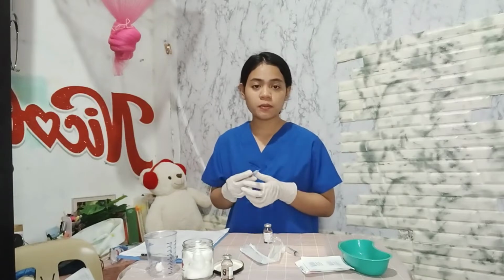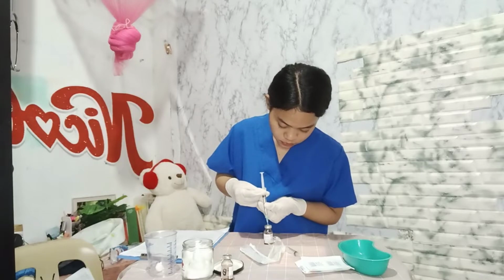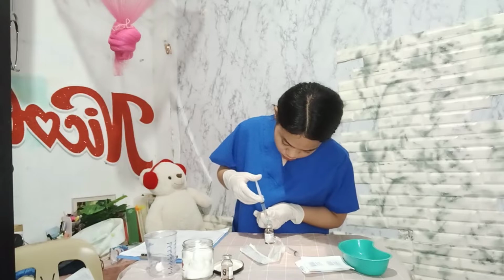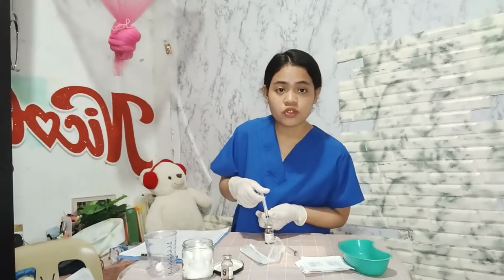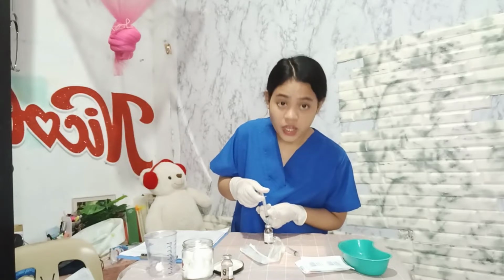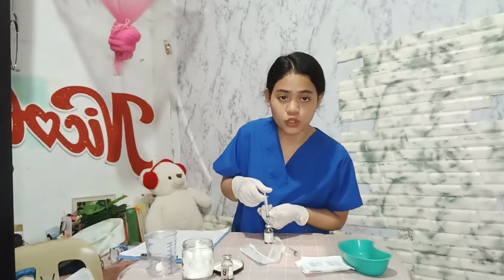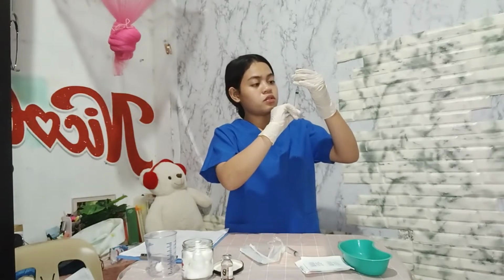Then inject the air into the vial by keeping the level of the needle above the surface of the medication. Then withdraw the prescribed amount of medication. There are two methods, but I am going to invert the vial to ensure that the needle tip is below the fluid level and gradually withdraw the medication.